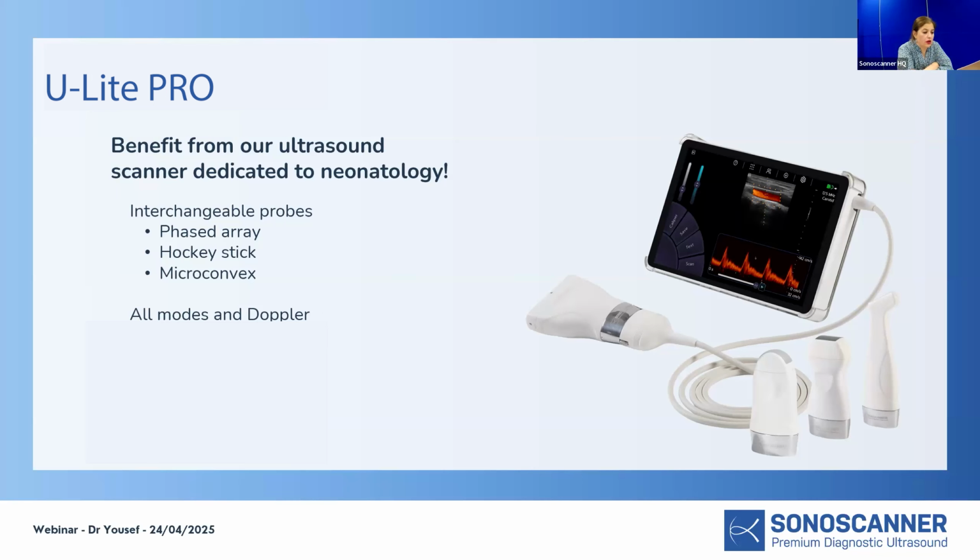What about specific patterns for chronic lung disease? Chronic lung disease is a very heterogeneous disease, and it's a large spectrum. So you would be able to see the whole spectrum. Some changes you will see depend on what stage you are at. It could be, in the beginning, that you have an interstitial pattern with consolidations.